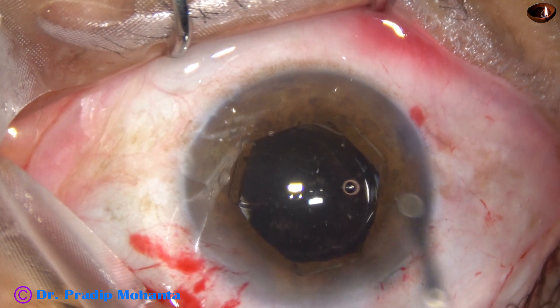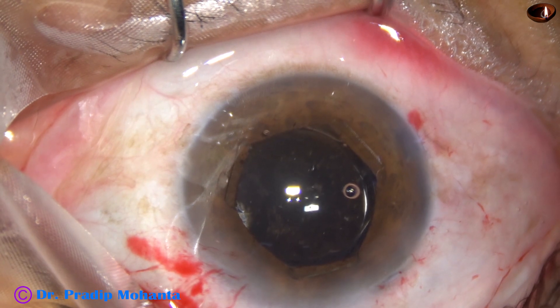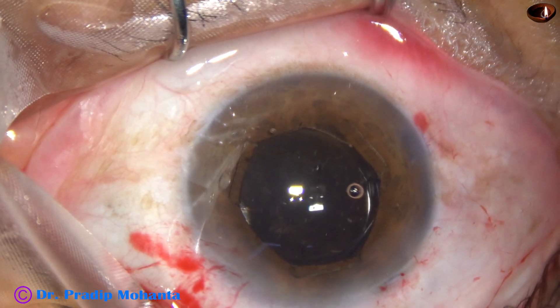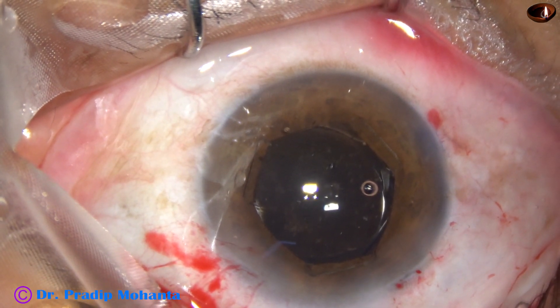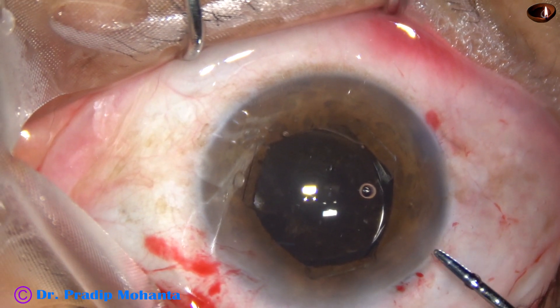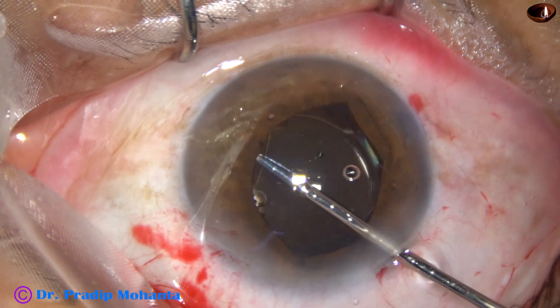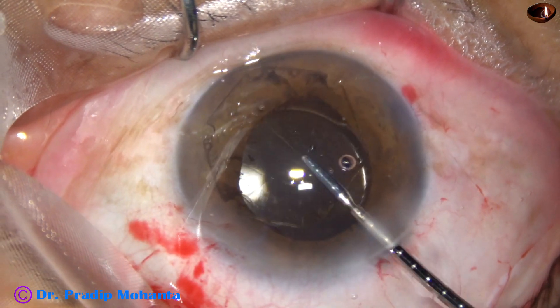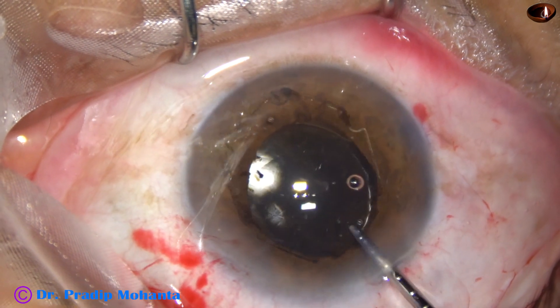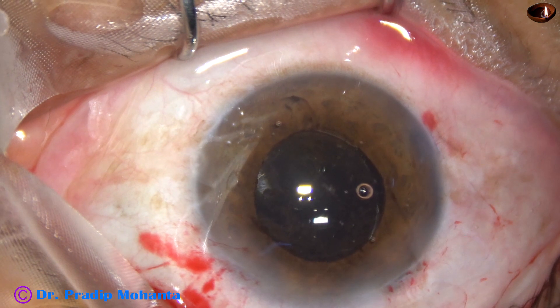Now I inject some more visco for removal of the B-Hex pupil expansion device. See how the device is removed — hold the flange at 4 o'clock, pull it centrally, then go to the periphery and just pull it out.